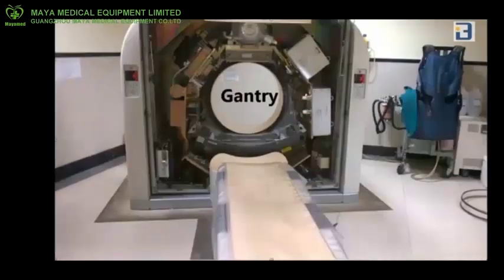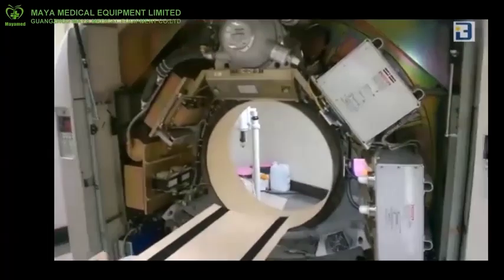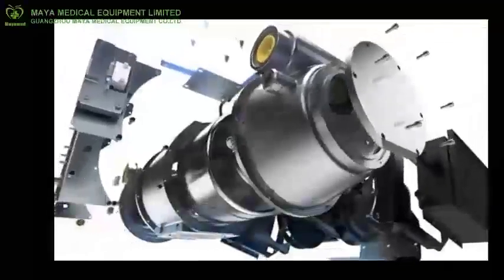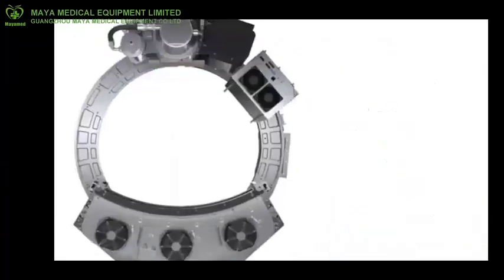The fourth component is the cooling system. Cooling mechanisms are included in the gantry. They can take many different forms, such as blowers, filters, or devices that perform oil-to-air heat exchange. Cooling mechanisms are important because many components can be affected by temperature fluctuations. The fifth component is the CT X-ray tube. X-ray tubes produce the X-ray photons that create the CT image. Their design is a modification of a standard rotating anode tube, such as the type used in angiography.